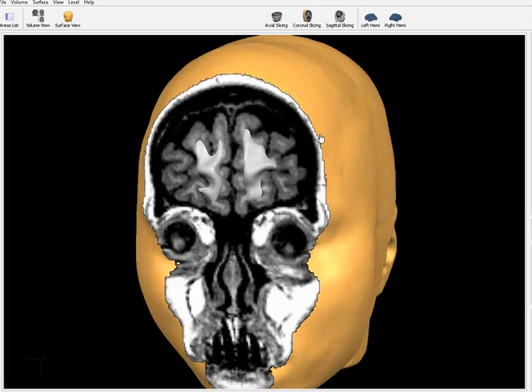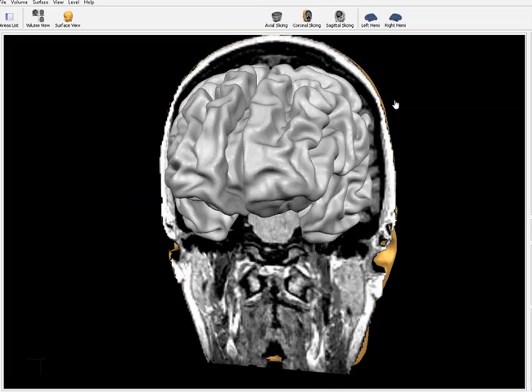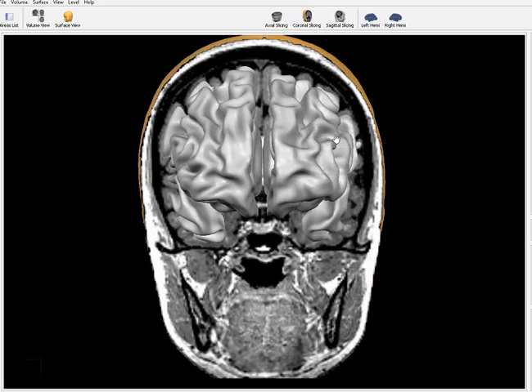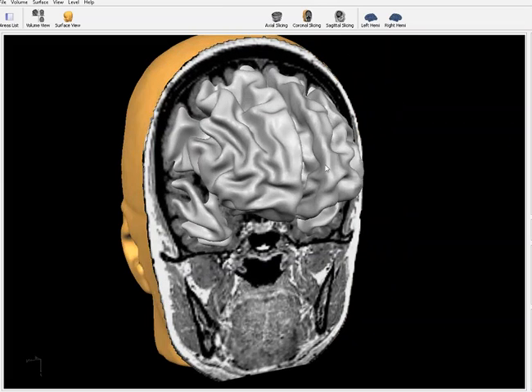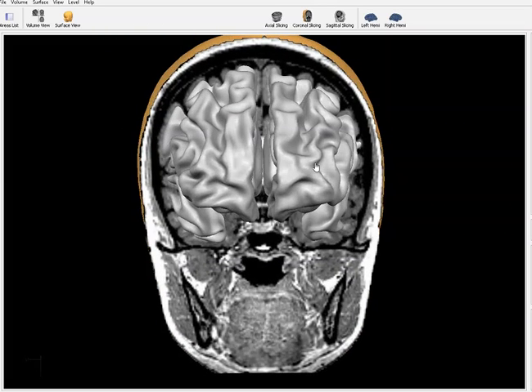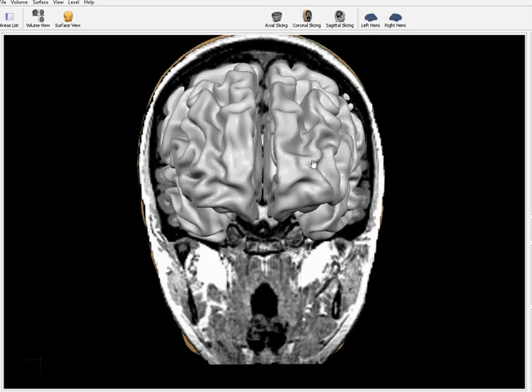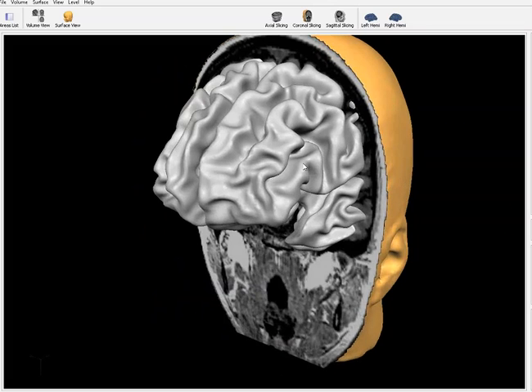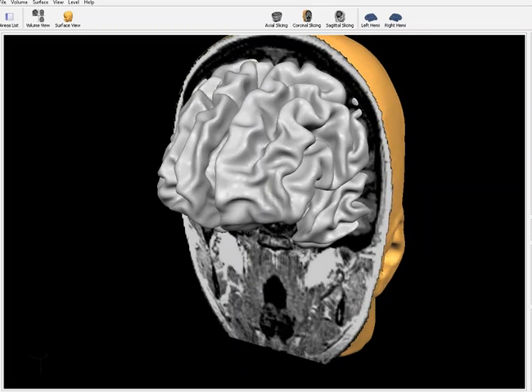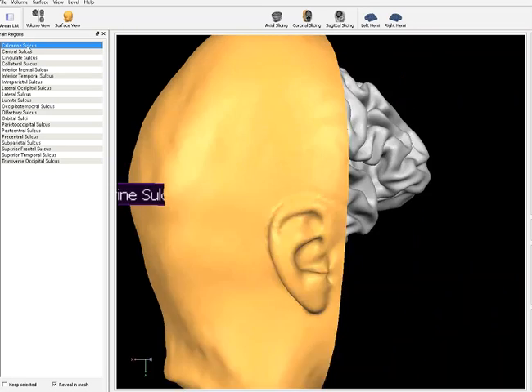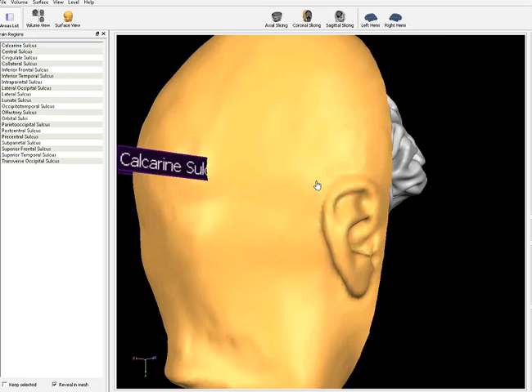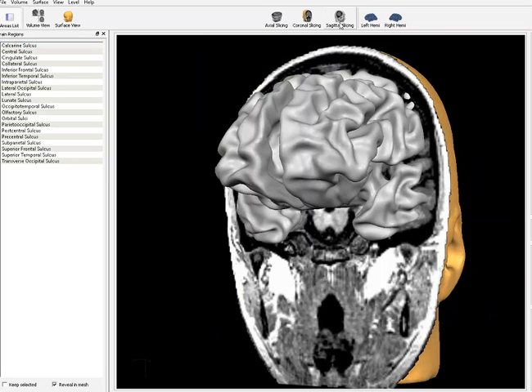You can go sagittally or coronally through the brain and look at it from different perspectives. On all of these views, you'll have the Z-score superimposed, so you can see regions greater than two standard deviations, or regions greater than three standard deviations. You'll be able to set your threshold and select particular Brodmann areas, or select all of them and scale them as a function of their deviation from normal.